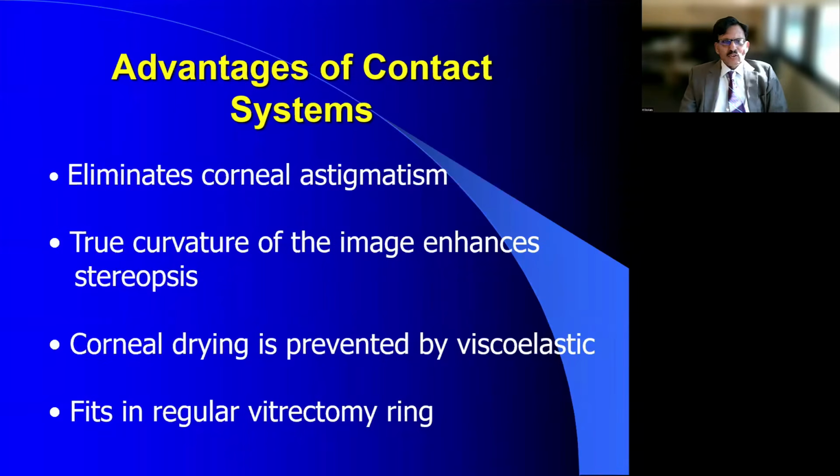So it is one thing to observe the pathology, it is another thing to do things to eliminate the pathology. So you require extreme precision of your hand-eye coordination with the instruments. For example, if you're trying to peel membranes or do dissections of very attached membranes, which are 50 to 100 times the strength of the retina, then it is extremely important you don't cause any iatrogenic holes in the retina by your own mistakes.